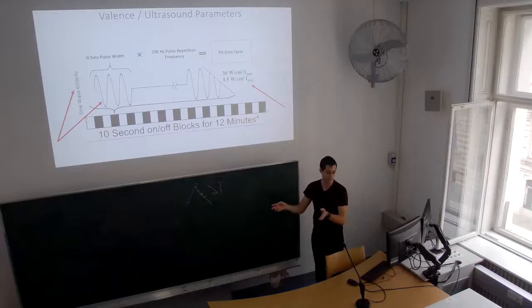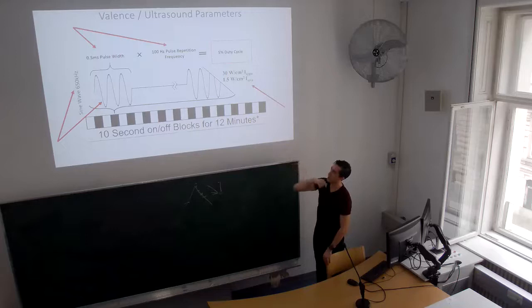But you'll notice these crazy things here, right? It's often not applied continuously. Sometimes it is, but it's often applied in pulses. Okay. So we started doing this as an analogy from deep brain stimulation or TMS, where pulses are super important to what we do to the neurons, right? The frequency of these pulses and such. Okay, so that's why we started doing this. And there's a whole range of things, right?